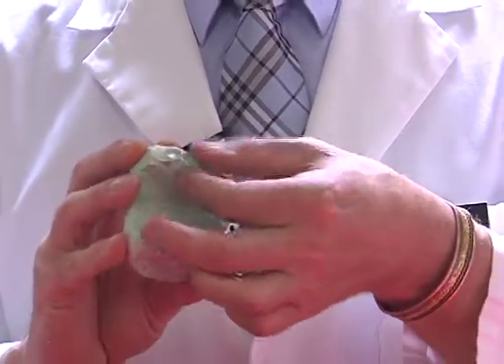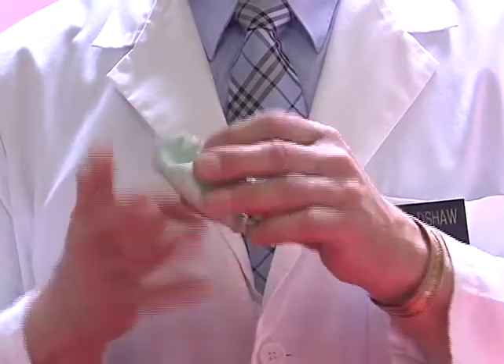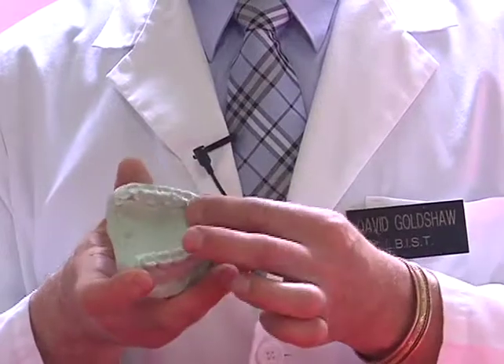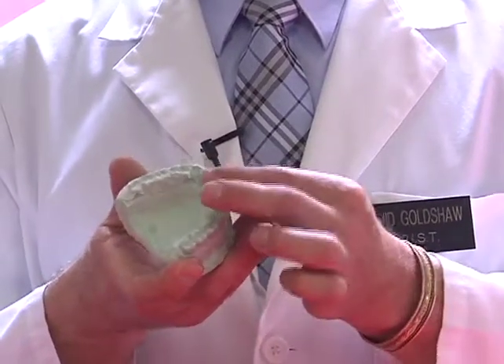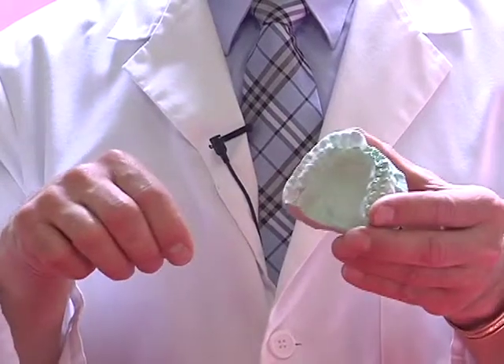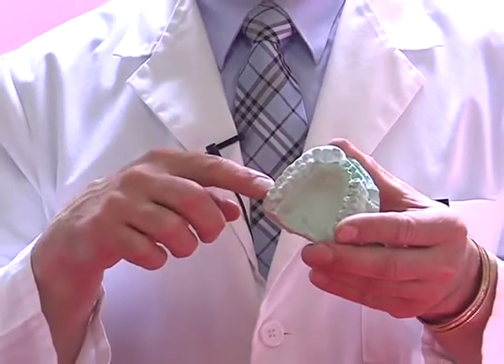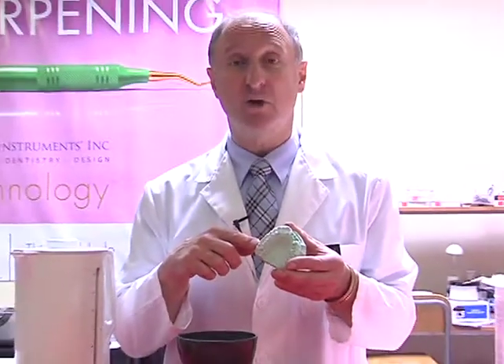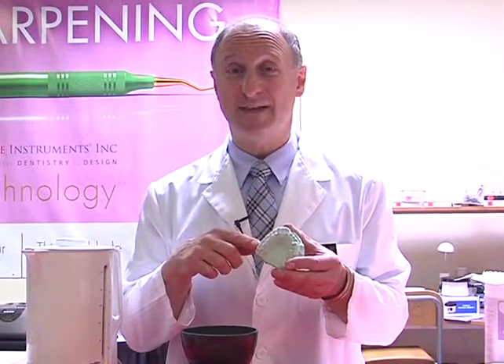It's very comfortable. So I'm just pushing it down lightly, interproximally, with small spaces, and then with a light finger pressure over. I then take my air water syringe and then lightly over the surface of the material until it turns white again. So it's normally about another 15 seconds. Total time here is 30 seconds inside the mouth.